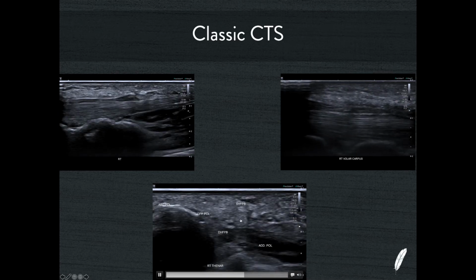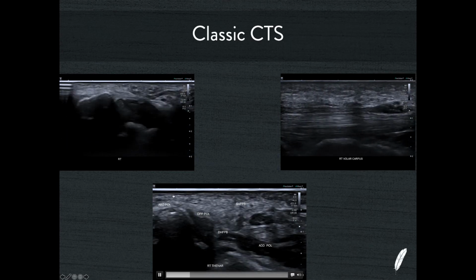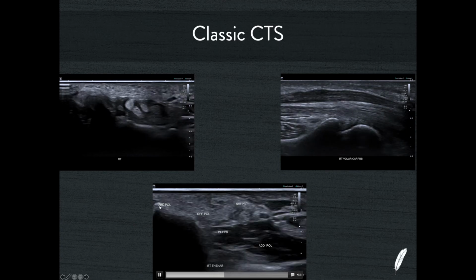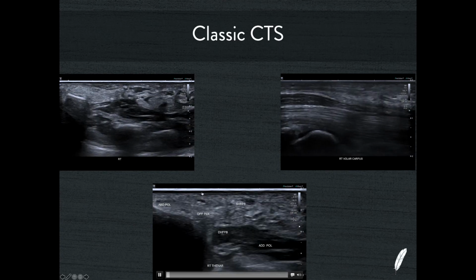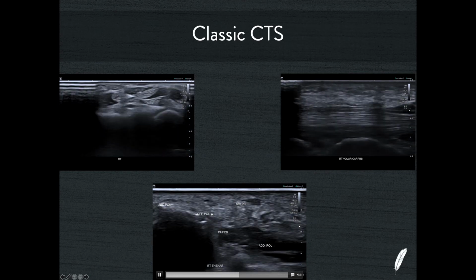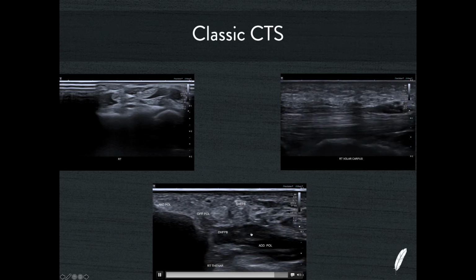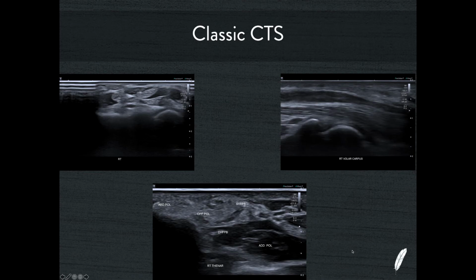It's really like a chameleon here, because the muscles of the thenar eminence, the abductor pollicis, the opponens, and the superficial head of flexor pollicis brevis, these were the blue muscles, are all atrophied away, and they're nearly as bright as the FPL. But the yellow muscles that are driven by the ulnar nerve are beautiful and black.